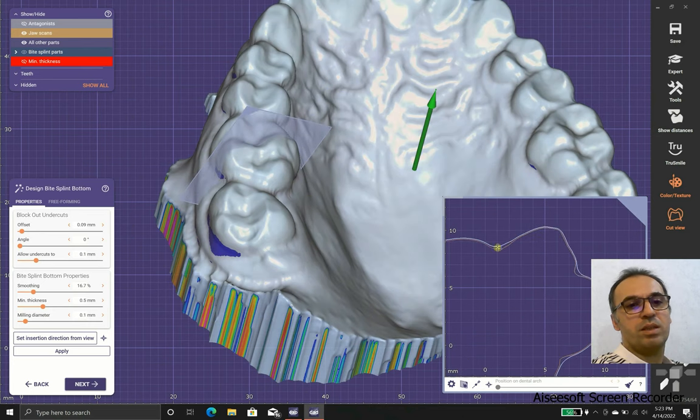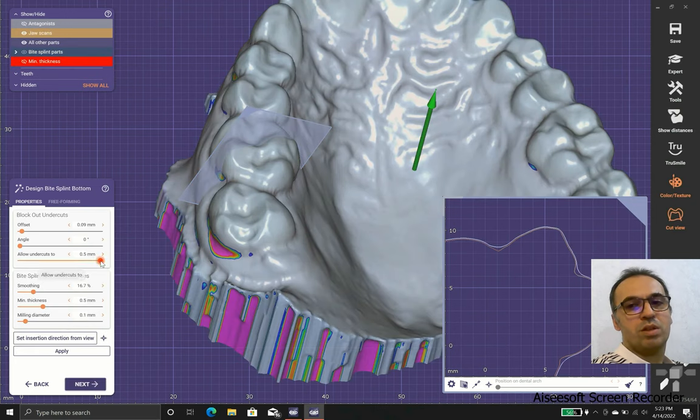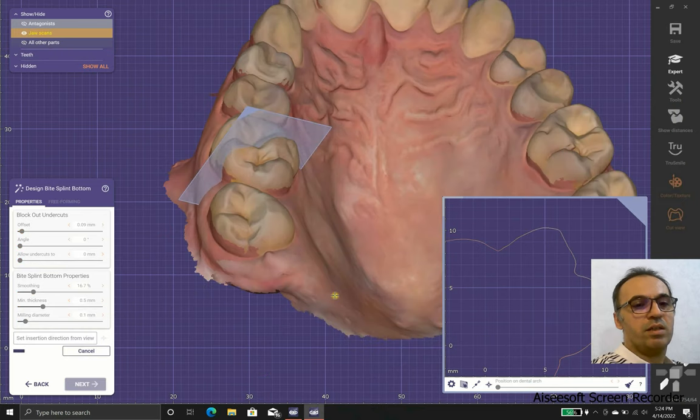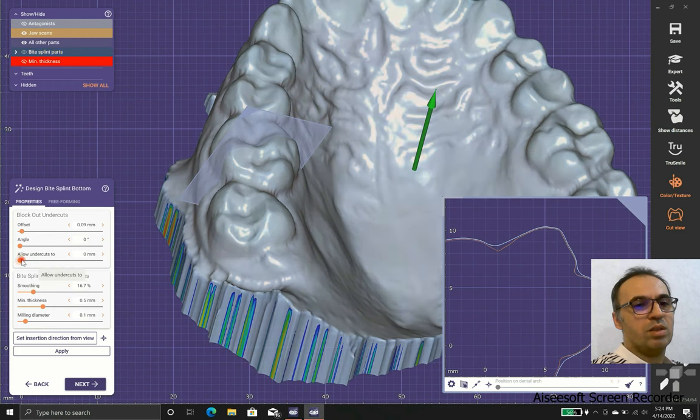The allow undercuts setting means that you are allowing your device to use undercuts under a tilt of 0.5 millimeters. But of course, using too much undercut doesn't allow your device to come off easily, and it doesn't allow the appliance to seat completely. So you should use these numbers wisely.